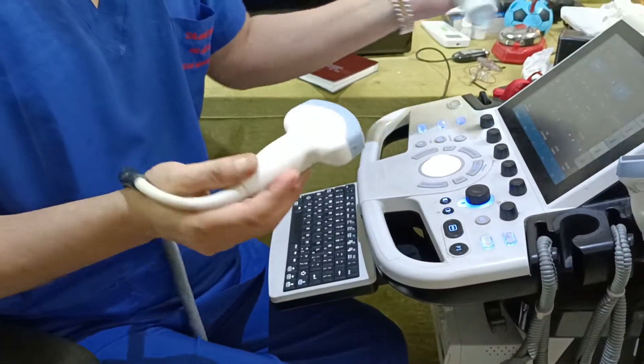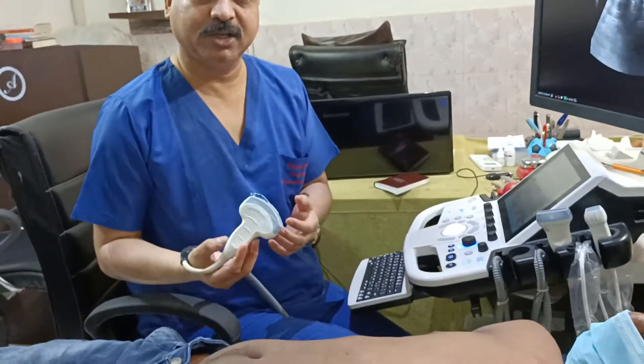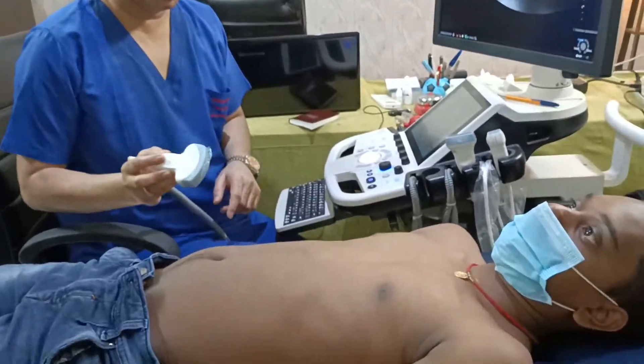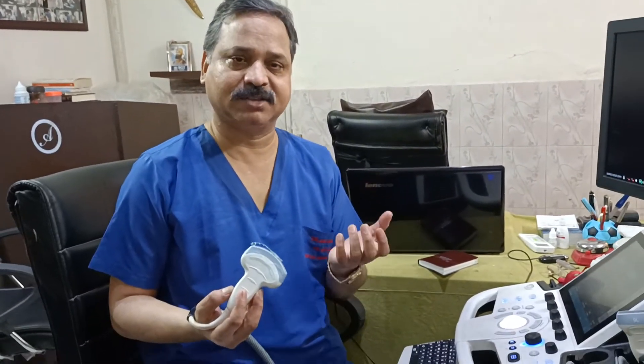Coming to the position of the patient — obviously if we are doing this scanning in trauma, the patient will be in supine and the orientation marker will be towards the head of the patient. We will be performing four views: the first will be right upper quadrant view, the left upper quadrant view, the subcostal view, and the pelvic view. And of course the EFAST scan will be scanning the chest as well.